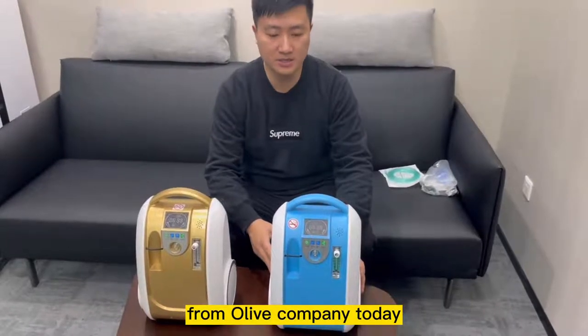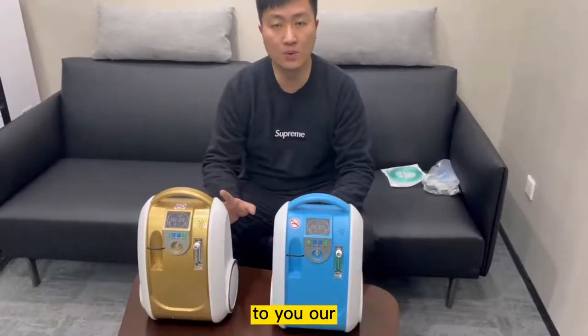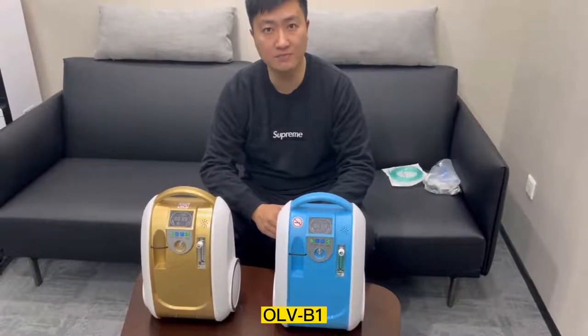Hello everyone, I'm Zach again from Olive company. Today we're going to introduce to you our healthcare oxygen concentrators, our OLV-B1.